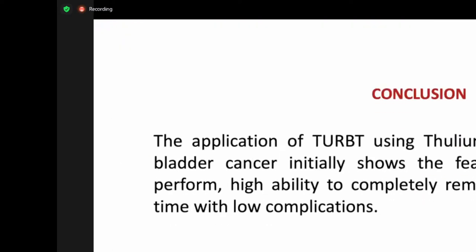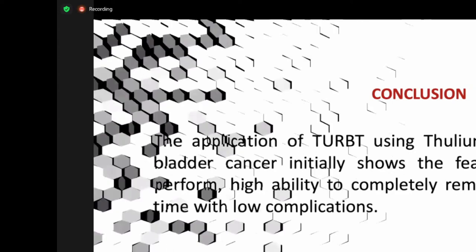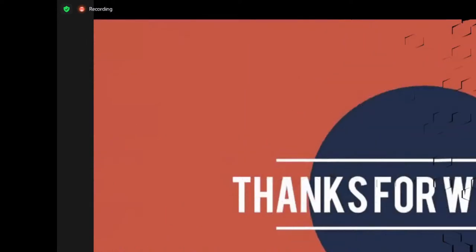In conclusion, the application of TURBT using thulium laser to operate on non-muscle invasive bladder cancer initially shows feasibility, safety, and ease of performance, with a high ability to completely remove the tumor the first time with low complications. Thank you so much.